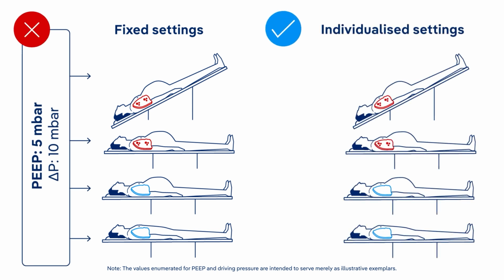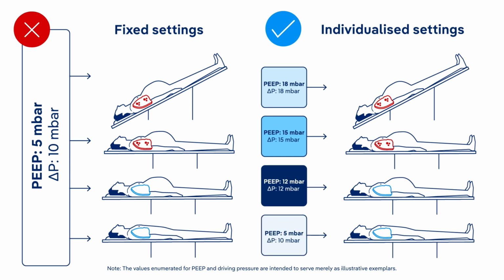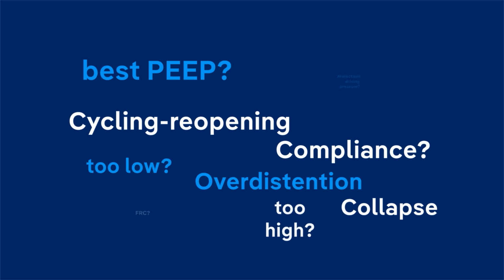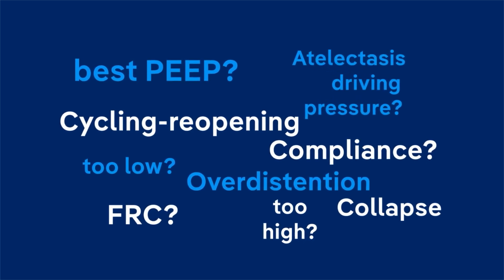Instead, an individualized, lung-protective ventilation approach should be considered, tailored to each patient's specific lung dynamics. Given the heterogeneous lung mechanics in these situations, finding the optimal PEEP can be especially challenging. But what if you could see, in the moment, what is happening inside the lungs?